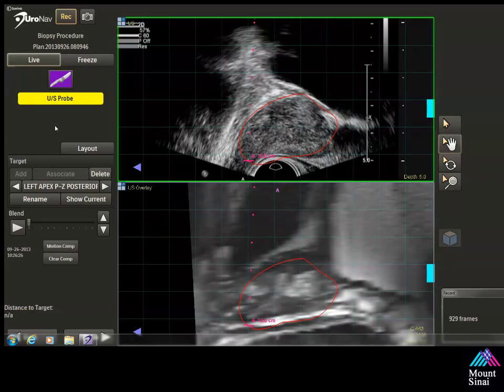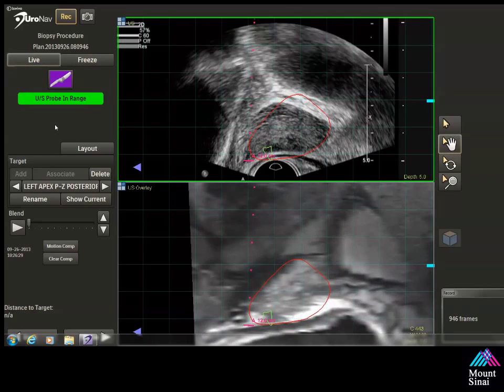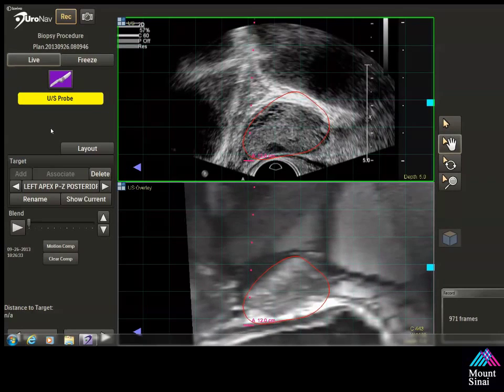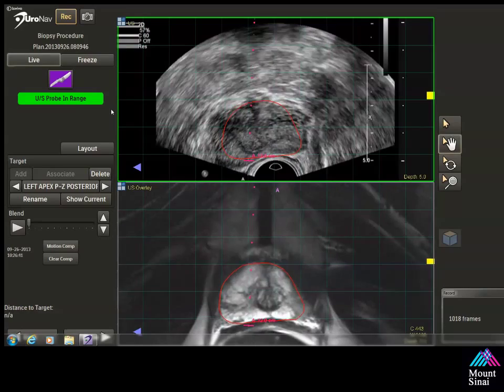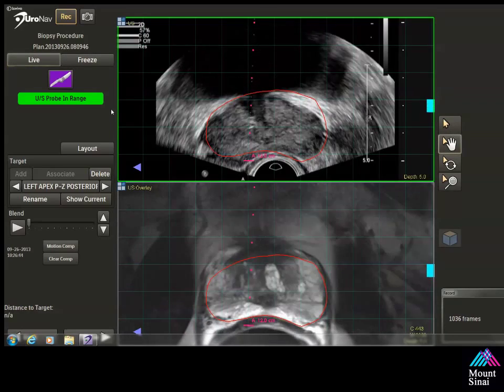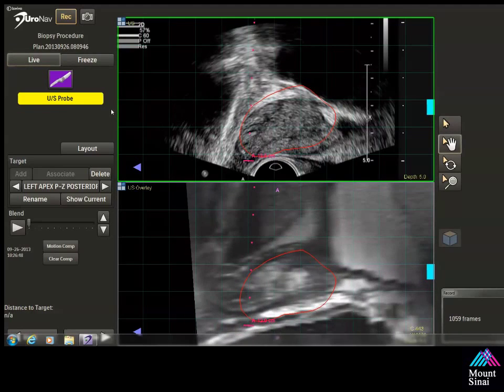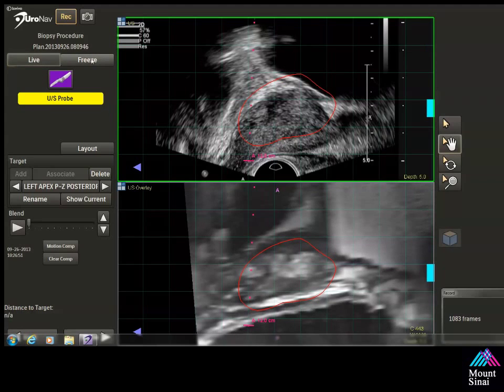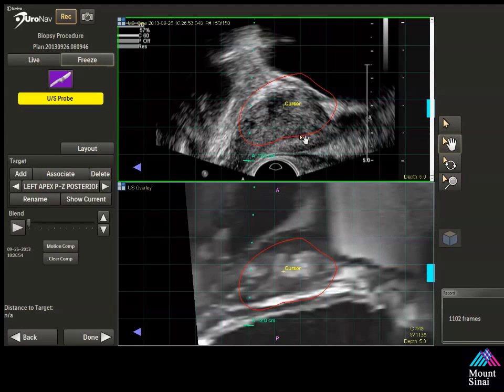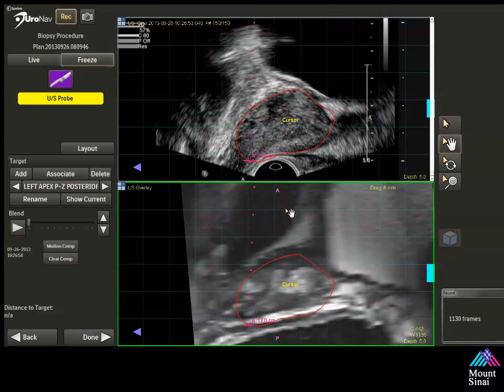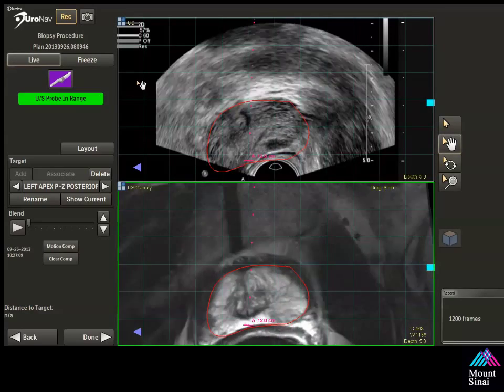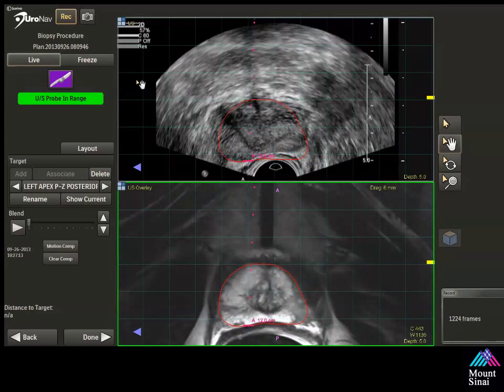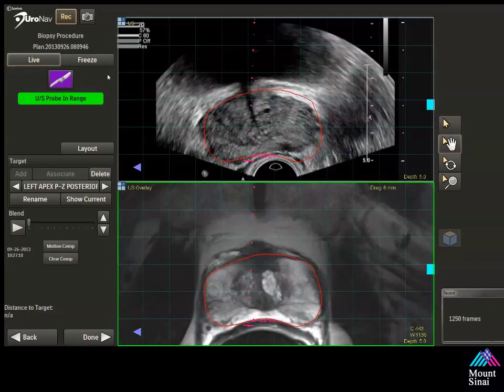This is another example of a fusion biopsy. In this case you'll see me struggle, adjust, and realign the MR image with the ultrasound image obtained live during the procedure. You can see the green and red cartoon which represents the MR-targeted lesion, and on ultrasound you appreciate a hypoechoic area. However, if you look closely, the red line does not exactly line up with the contour of the ultrasound image of the prostate. During this procedure you'll see multiple times we freeze the screen and realign the prostate image. The tech is adjusting the MRI to match the contours. I continually shift between axial and sagittal views with my biplane ultrasound probe, which allows us to check the registration in multiple planes.